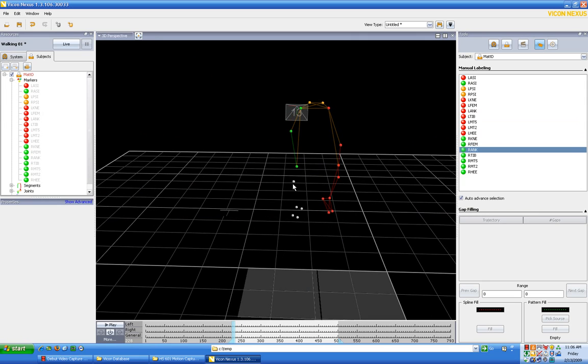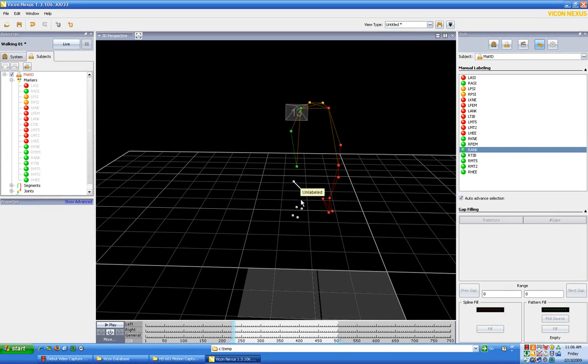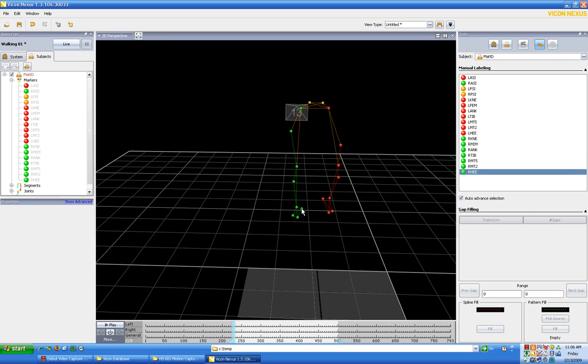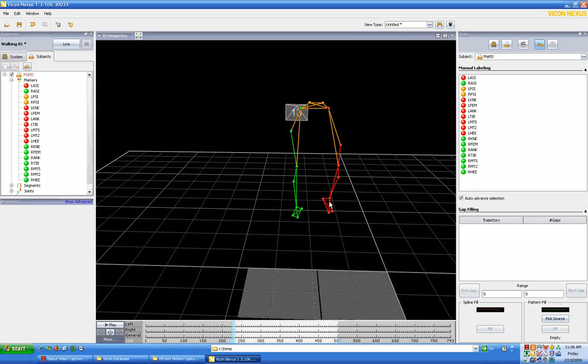You need to actually click on a dot and you need to get that centered in your crosshairs. You'll click around and get a feel for that. So now I labeled the first frame. Now let's hit the escape button on the keyboard and that gets us out of labeling mode.